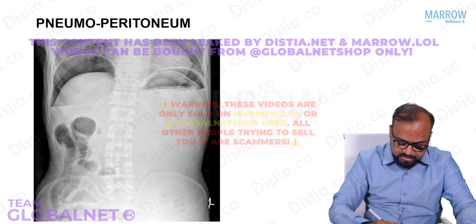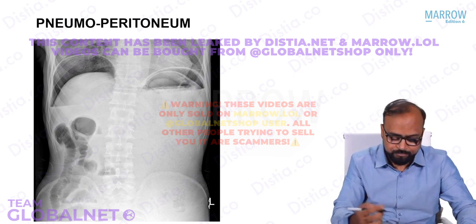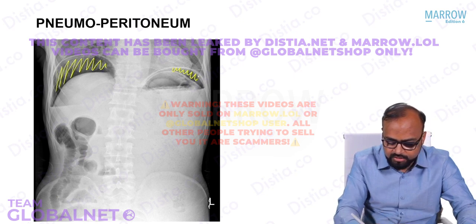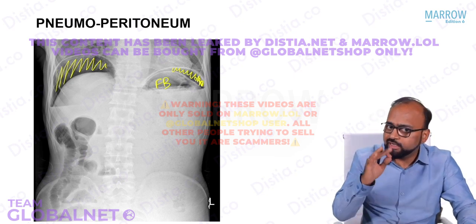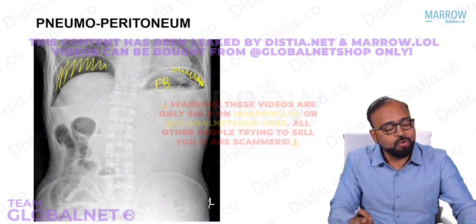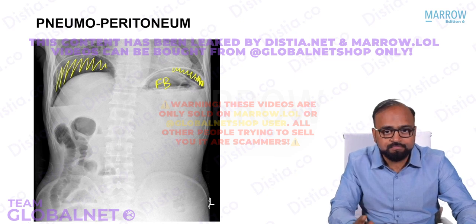So see here, the easiest way to diagnose pneumoperitoneum, whether you're looking at a chest radiograph or an abdomen radiograph, is to always visualize the areas under the diaphragm. Under the diaphragm, we have seen a jet black hyperlucent appearance. So this actually is the fundic bubble, but you can see free air separately. So this is free air under both domes of diaphragm. Whether you're looking at a chest x-ray or an abdomen x-ray, make it a point that you always look below the domes of diaphragm, because as I said at the start, you just cannot afford to miss this particular diagnosis.